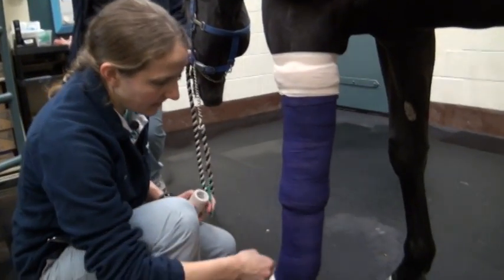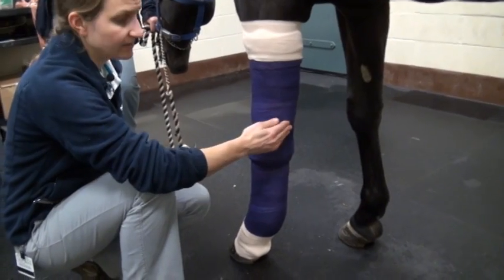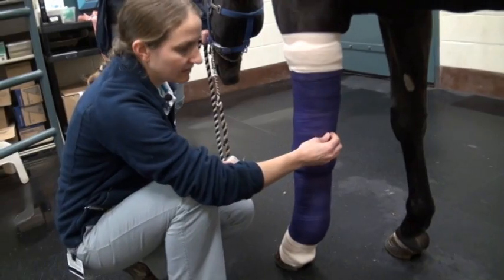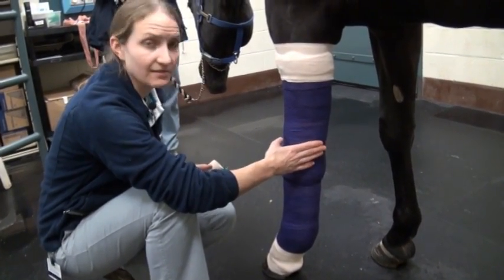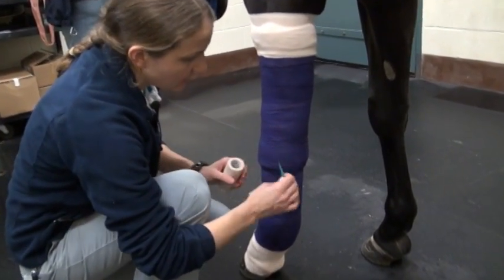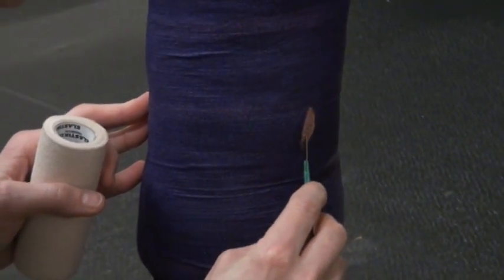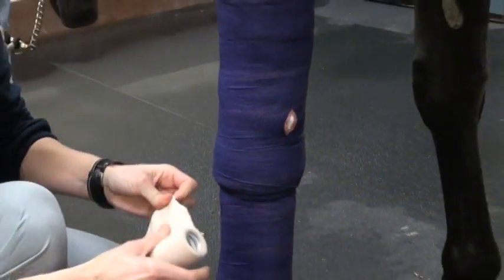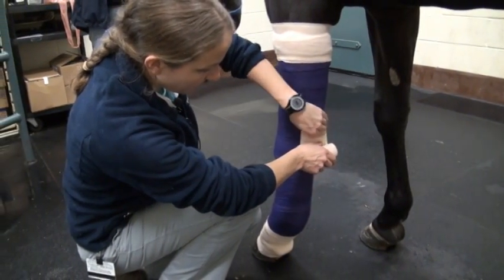When placing a stack wrap, your bandage will go over the horse's natural bony protuberances like their accessory carpal bone or in the hind, the point of their hock. It's important that we make a small cut in the bandage in order to relieve any tension that we've placed over these areas as they're more prone to bandage sores. With this, we can use a scalpel blade or a pair of scissors to make a small cut in the bandage that goes through both the vet wrap and the brown gauze so you can see your white bandage material underneath. Once you've made this cut, this area should be overlaid with a small piece of elasticon in order to keep any debris from working its way into the bandage.